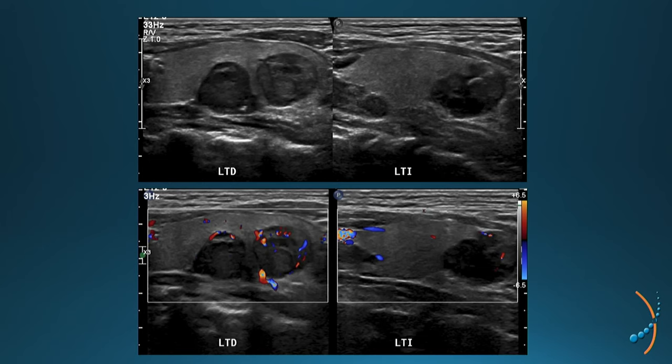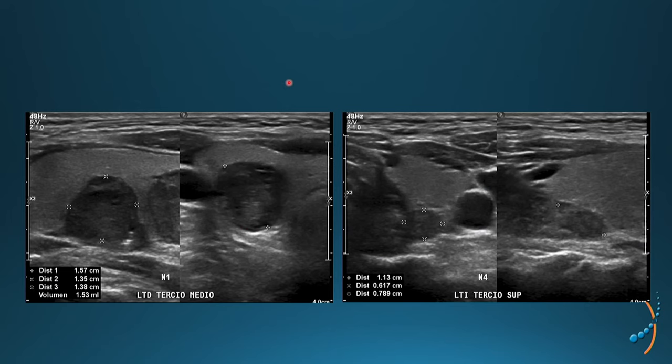We perform an ultrasound of the neck where, in the sagittal section of both thyroid lobes, two images per side are identified, which are projected extrathyroid, posterior to the thyroid gland. Each one of these images is oval with defined edges, hypoechoic in comparison with the thyroid parenchyma. Some of them have small areas of colloid degeneration inside.